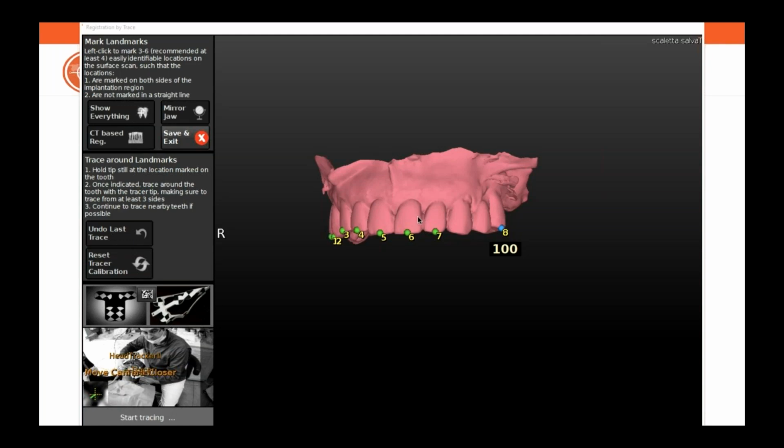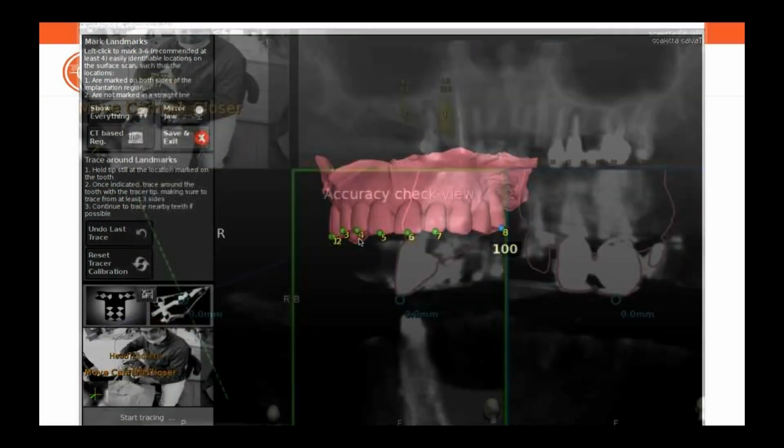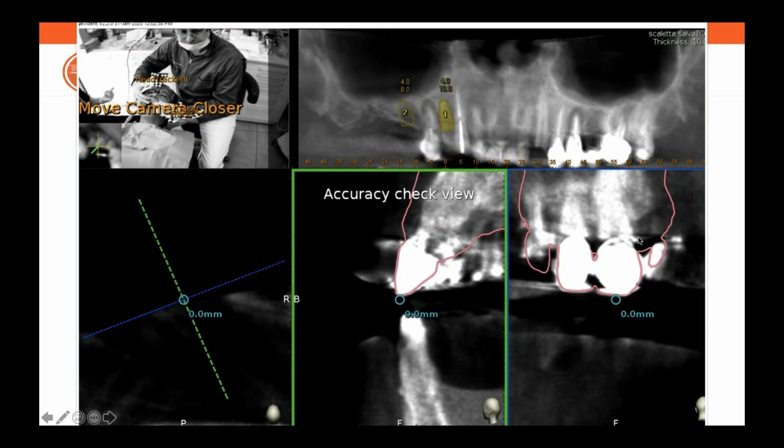Basically, once he reaches 100, he has the opportunity to finish the activity, and that is basically the end result.